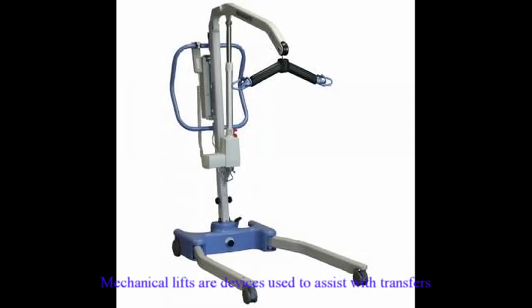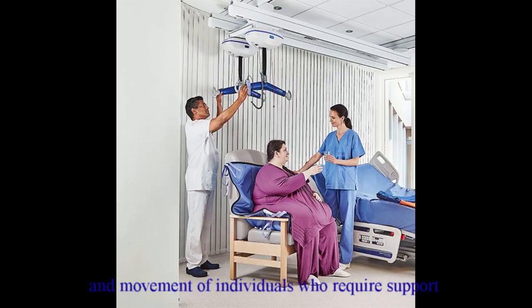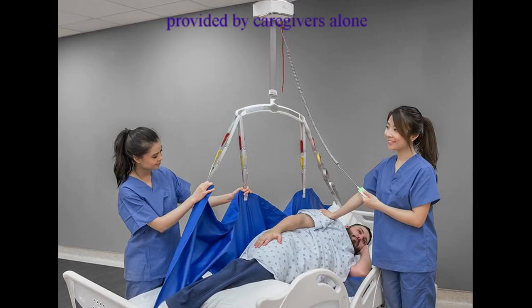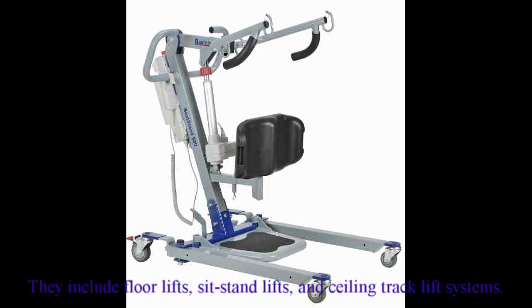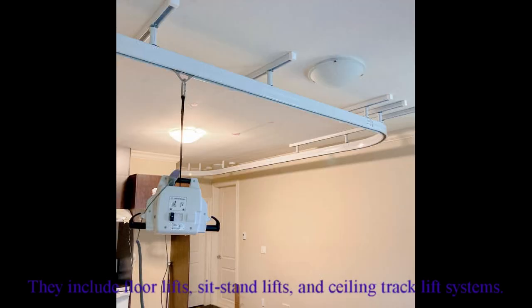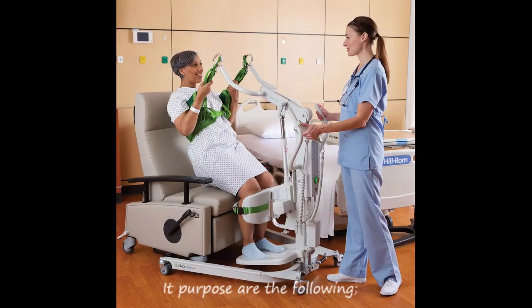Mechanical lifts are devices used to assist with transfers and movement of individuals who require support for mobility beyond the manual support provided by caregivers alone. They include floor lifts, sit-stand lifts, and ceiling track lift systems. Its purposes are the following.